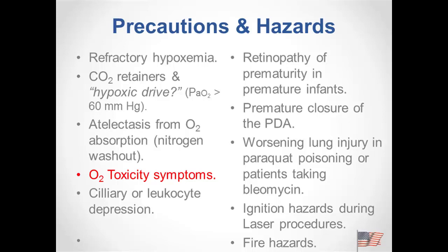There's more to it than that. But COPD patients, you've got to be careful, especially with low-flow devices. What happens to the FiO2 as minute ventilation falls? It increases, which is only going to make matters worse. So you get this cyclical process.